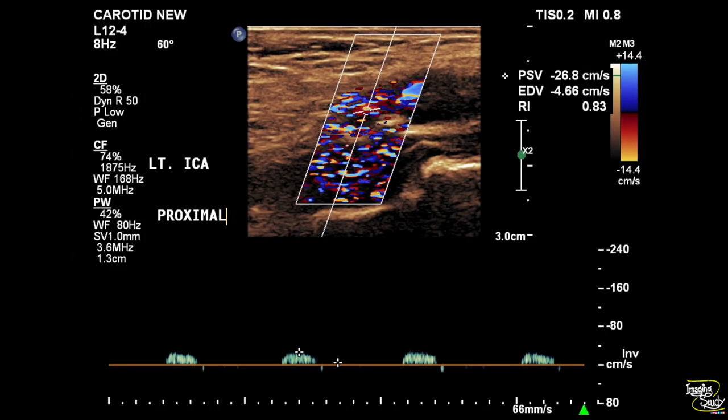Here's a sample taken from the proximal part of the internal carotid artery. You can see a very low monophasic wave pattern with absence of diastole, indicating nearby occlusion.